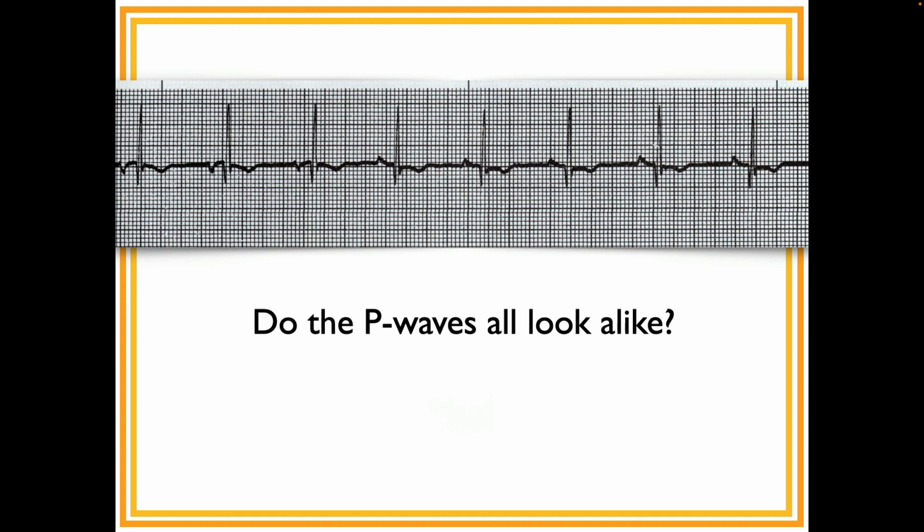Riley, what about this? P waves look alike. Let's see. No. I mean, this is really weird. Some of them are upside down, some of them are right side up. They're different sizes, different shapes. And next week, you'll learn what this is. But for now, all we're doing is answering the P wave questions.